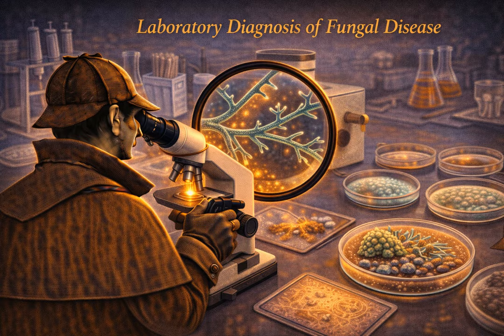Let's look at Aspergillus first. It's a very highly structured, organized organism. Under the microscope, you see septate hyphae. That means the filaments have those little regular cross walls. They are very uniform and very tidy looking. And they branch at a characteristic 45-degree angle. Acute angles. 45 degrees, septate, tidy.